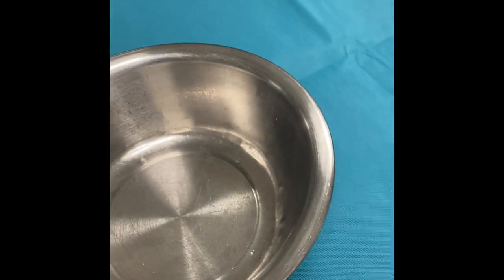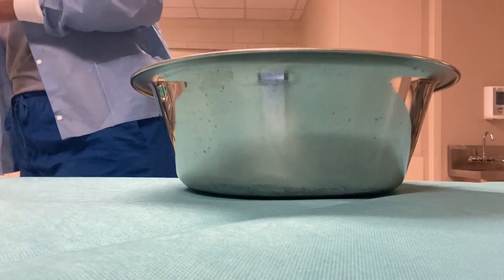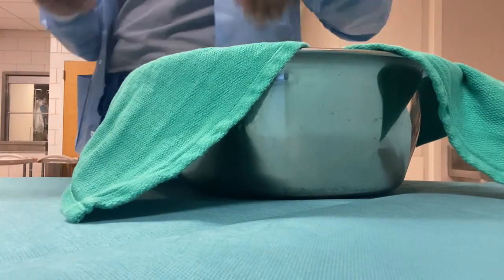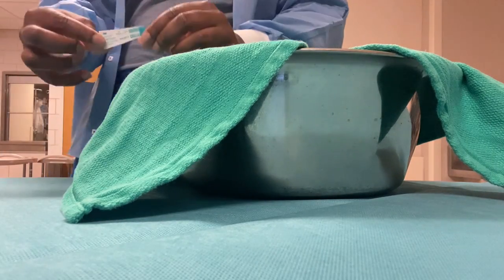Next, I will place my towel. Position. Indicator.